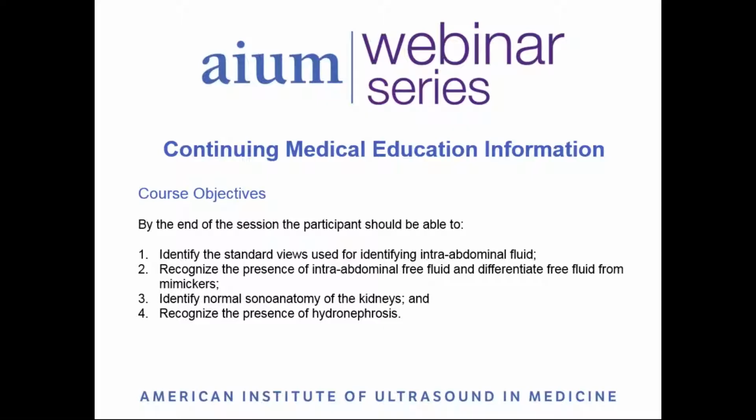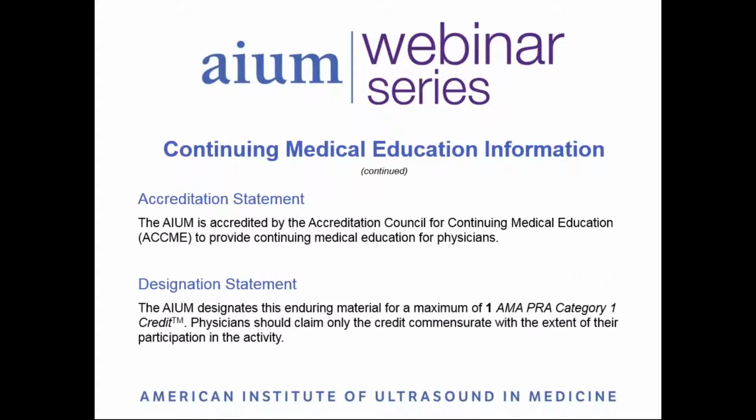At the end of this webinar, participants should be able to identify the standard views used for evaluating intra-abdominal fluid and identify normal sonoanatomy of the kidneys.